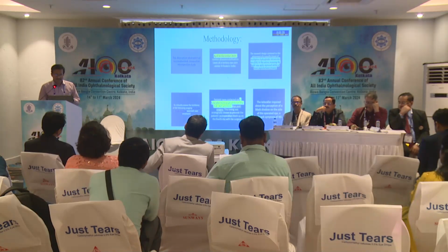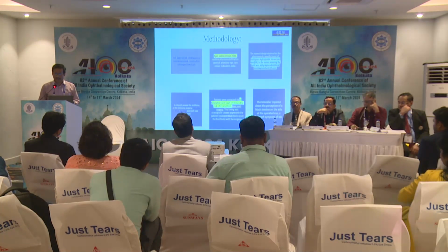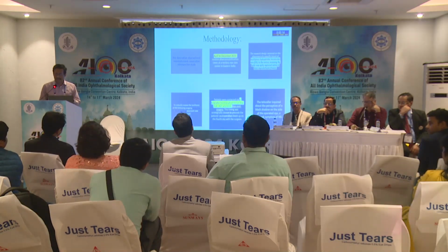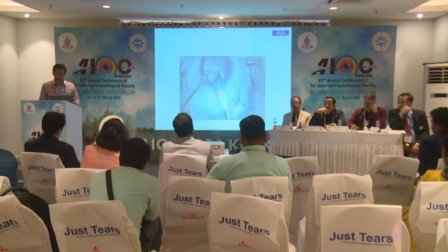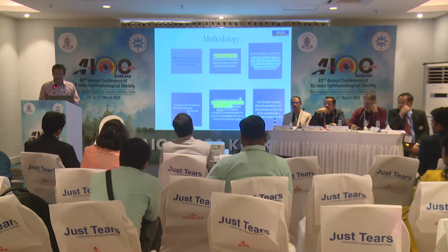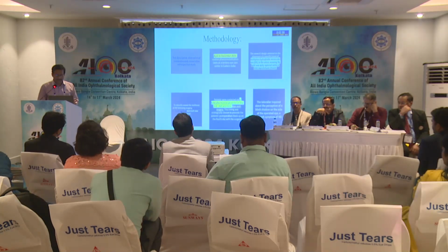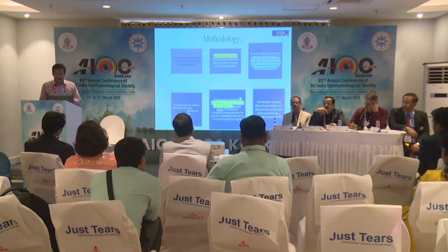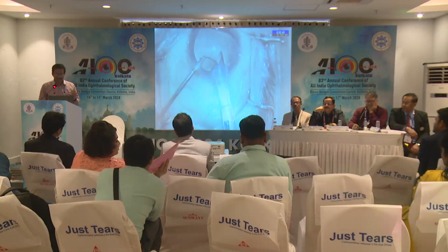So, it's a descriptive, observational, non-randomized, consecutive retrospective study done between April and December 2023, where a particular brand of hydrophobic acrylic multipiece lens is placed in the sulcus, and the optic was captured inside the bag of a 5.5 millimeter rhexis. A double masking is done whereby a telecaller would call up the patient on the second postoperative day, before the patient reports for first follow-up to the doctor. So there is no bias, and the telecaller inquires about the black shadow and notes it down. Here is how it is done.